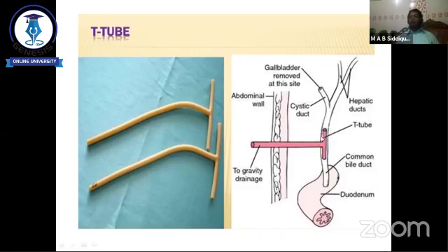But in case of a silicone tube, there is no difference between the two limbs, as it is very soft, so it is very easy to remove. That's why there is no need of an angle. But this tube has two angles, one acute and one obtuse.